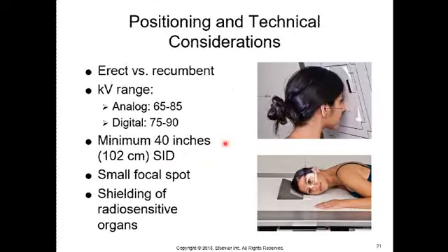As I mentioned earlier, there are going to be several questions about positioning considerations. So there will be situations that you have to actually think about. How did I position the patient, or how would I change the positioning? Again, that's all in the evaluation criteria for the projections you're responsible for in cranium.